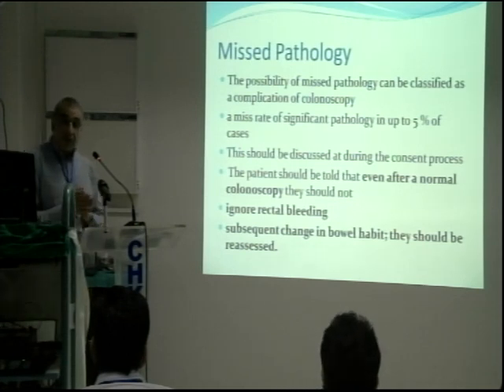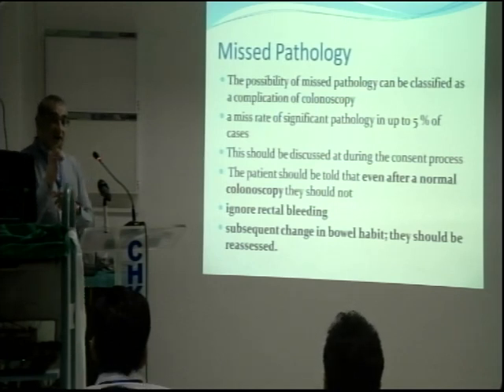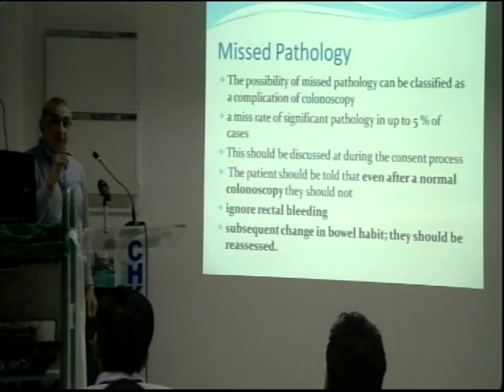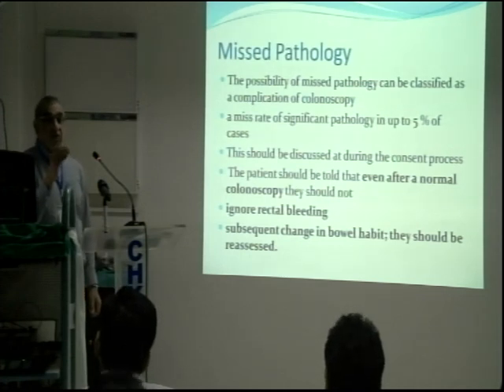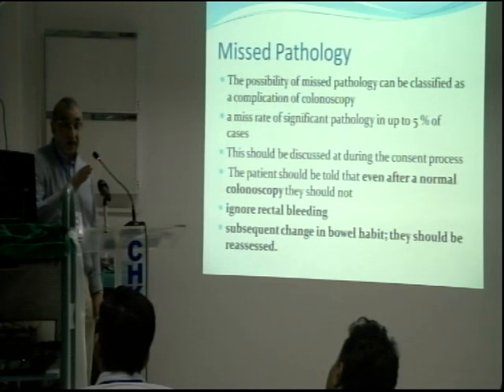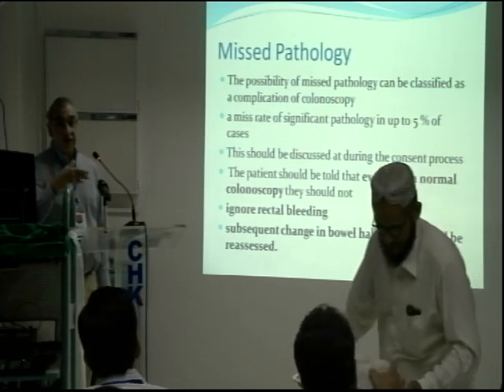It makes it all the more important to improve your colonoscopy technique, because there is a certain criterion in determining your level of colonoscopy, and that is ADR. ADR stands for adenoma detection rate. The higher your adenoma detection rate is, the better colonoscopist you are. All it means is that when you are doing a withdrawal of the scope, you are looking at the colonic mucosa very meticulously and very clearly. Because a lot of people, when they do a withdrawal very quickly, can potentially miss a lot of lesions.